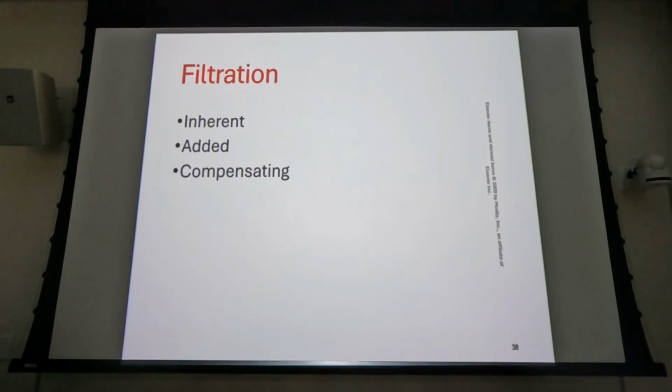You get no characteristic radiation that you would expose a breast to out of a tungsten x-ray tube. The kVp that you're going to be using for mammography, if anybody goes into mammography, is like 30, maybe no more than 40 kVp. Where's our characteristic spectrum? 69, right? So they're going to use a molybdenum target in mammography. So the Bremsstrahlung spectrum completely changes and all that.